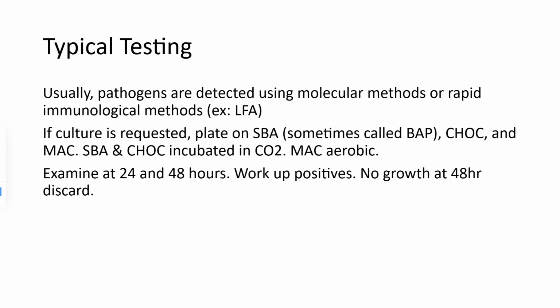So, just kind of reminding you about what some of these media are, because you will definitely have to know what the media are and what's in them and what makes them selective and differential, what they're used for in the clinical lab once you get into some of the exam questions for this class, but certainly those qualifying exam questions.